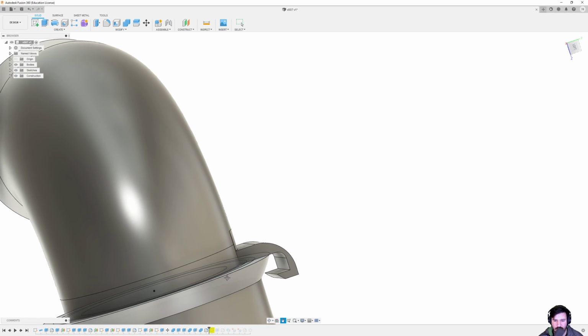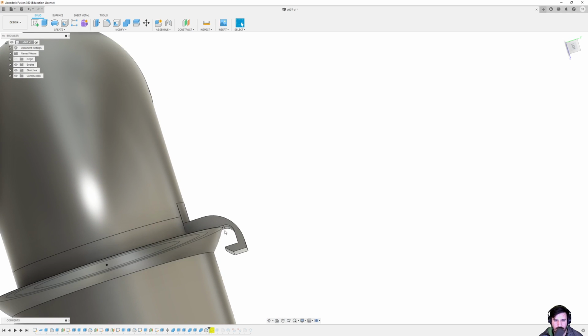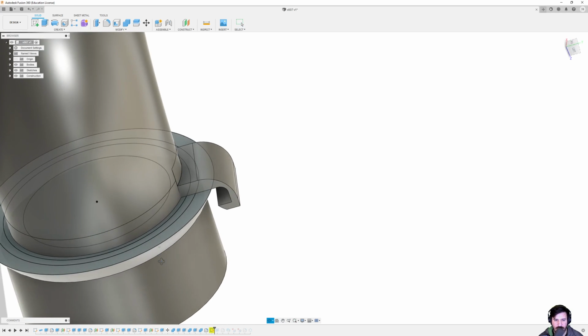And then I put a fillet on there just to the front and back, just to make it, again, you get this area to be thin but strong and not to have quite so right angles, so that if it flexes on that curve, it's a little bit stronger in the flex than it is if it's just straight up a square. This is that offset, that sketch that I think doesn't have a home.